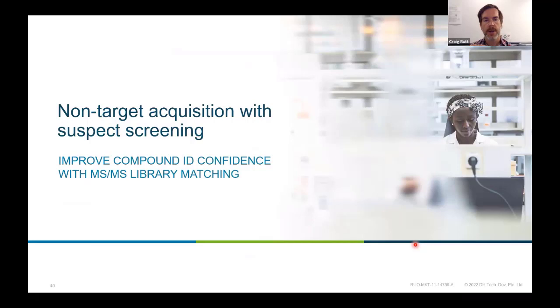So that's one technique for using accurate mass, really, is to mass resolve, get rid of those biological interferences, which ultimately may cause false positives, and take advantage of that. You'll notice that I was able to use a certain chromatographic gradient to try to separate them out.